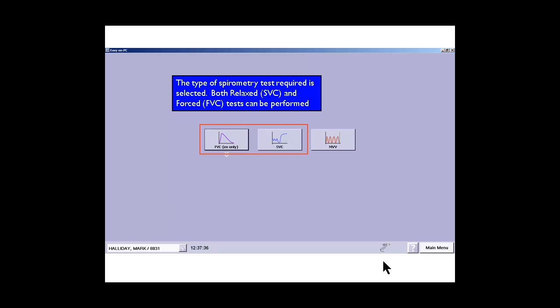We can choose the forced vital capacity or an SVC relaxed vital capacity. We will go straight into the forced vital capacity in this presentation.